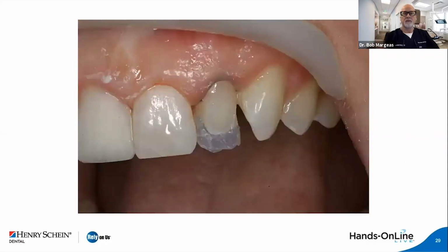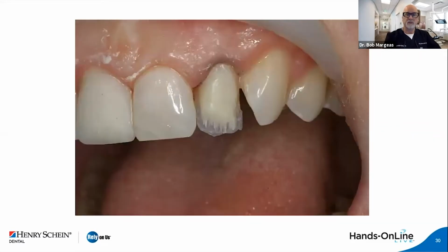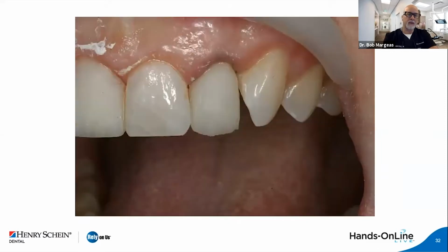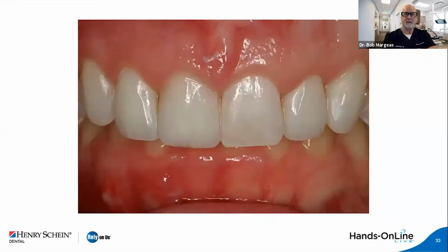Once again, on the other tooth, we're going to place the enamel white, place our dentin to try to replicate what we see in the adjacent teeth. Translucent shade on the interproximal. Today, what I'm going to do, instead of using the translucent shade on the interproximal, I'm going to use a tint. There's a number of ways to do it. I learned tinting from Dr. Buddy Mopper, who was an excellent cosmetic dentist until his retirement, still teaches around the country. And so here we place our enamel shade, and I'm going to place one more incisal shade at the incisal edge.